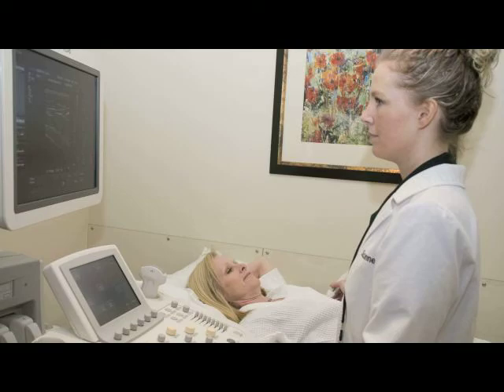Hi, my name is Dr. Dan Settle, one of the breast interventional radiologists here at Zwanger-Paseri Radiology. Your recent breast sonogram identified an area of concern and your doctor has asked that an ultrasound-guided aspiration procedure be performed for further evaluation.